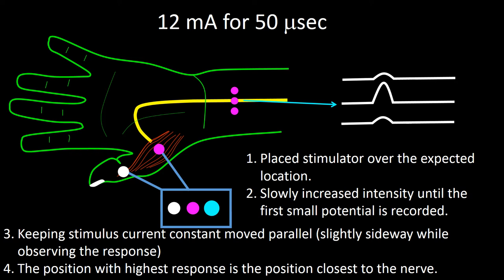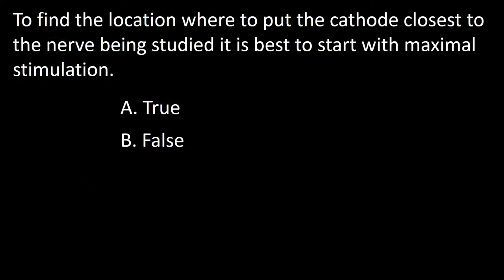Or another possibility is that you do not get a large response, in which case you should continue to move the stimulator parallel in the direction of the thumb. So the answer to this question is false.